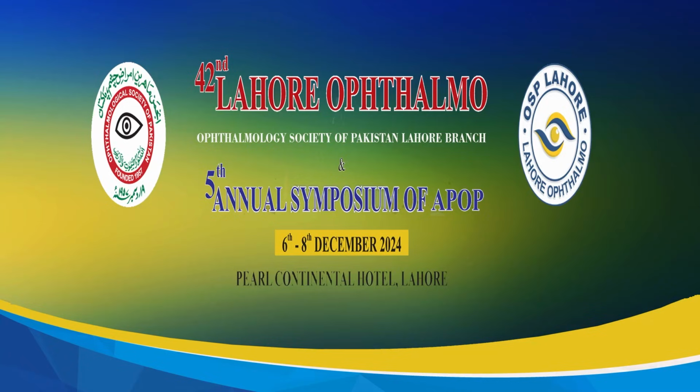One thing is for sure, that obviously you use triamcinolone to highlight the vitreous. So उसमें आपको जितना नजर आ रहा है vitreous वो आप remove करें. लेकिन over the top vitreoretinal surgery में याद रखें कि मैं अपने स्टूडेंट्स को भी ये कहता था कि हीरो बनने की जरूरत नहीं है, क्योंकि जो पर्पस अगर आप अचीव कर रहे हैं उससे एक स्टेप आगे जाने की कोशिश ना करें, बिकॉज देन इफ यू स्टार्ट हैविंग कॉम्प्लिकेशंस देन आपका सारा प्रोसीजर जो है ना वो डाउन द ड्रेन चला जाता है.